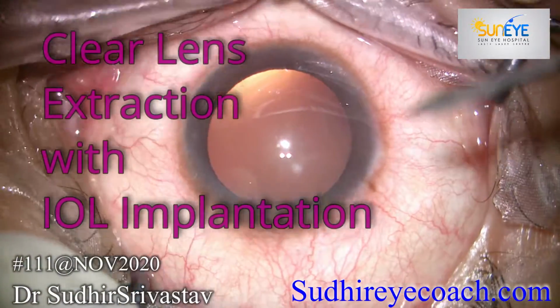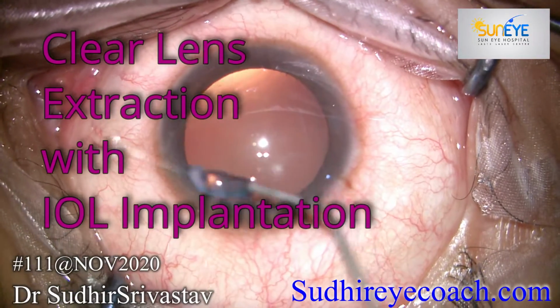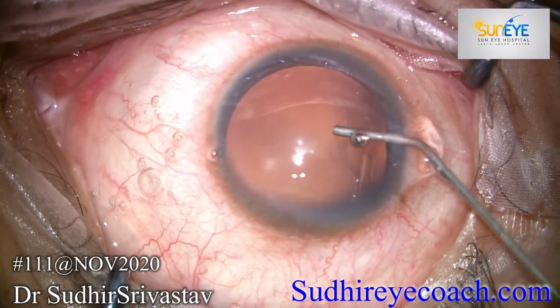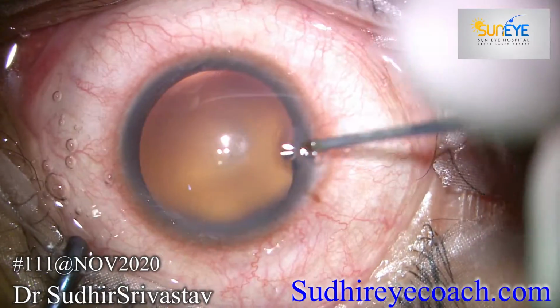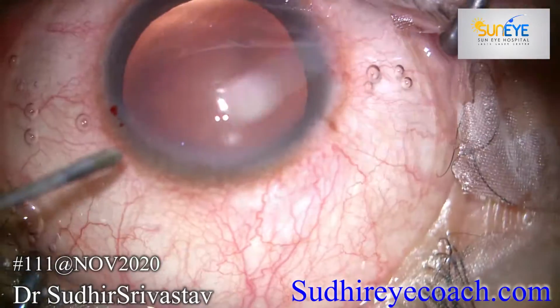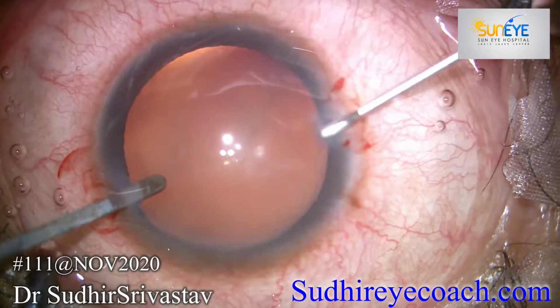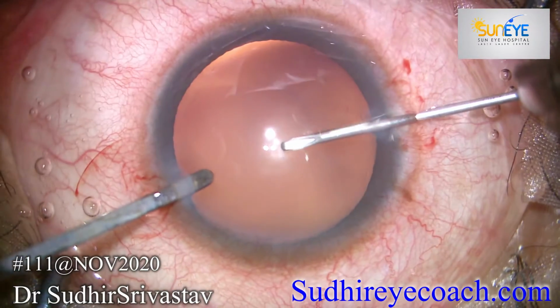Hello everyone, today I'll be sharing a video of clear lens extraction with intraocular lens implantation in a high myopic eye. This patient had -28 diopters of myopia and was not fit for laser vision correction, and was not even fit for phakic IOL because his anterior chamber depth was unusually low. Therefore, we planned for clear lens extraction with intraocular lens implantation.